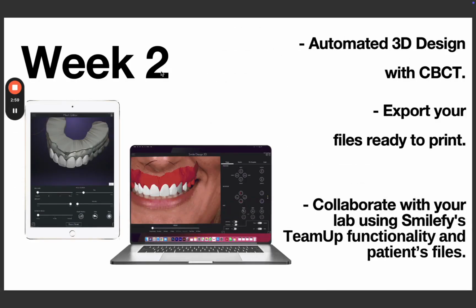During the second week, I will teach you step by step how to use the automated 3D design workflow. I will show you how to create your first mock-up design and how to export your files ready to print. You will also be learning how to collaborate with your lab using SmileFy Team Up functionality and how to export all the patient files that are needed.